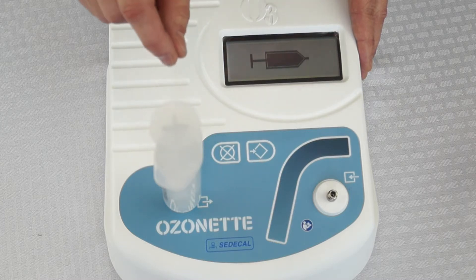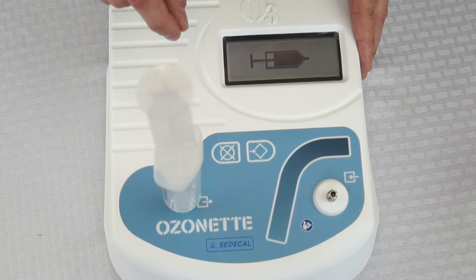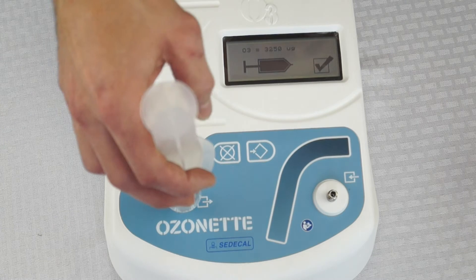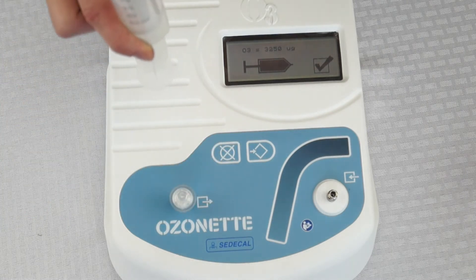When the syringe is full, the Ozone Net will automatically shut off and tell you how much ozone is in your syringe. That is all there is to it.